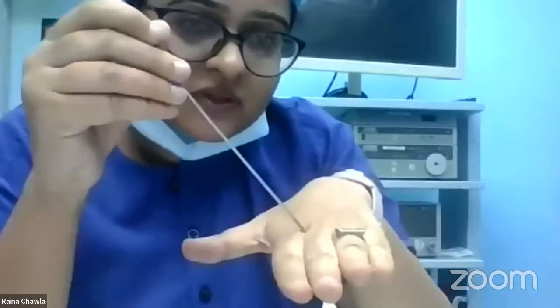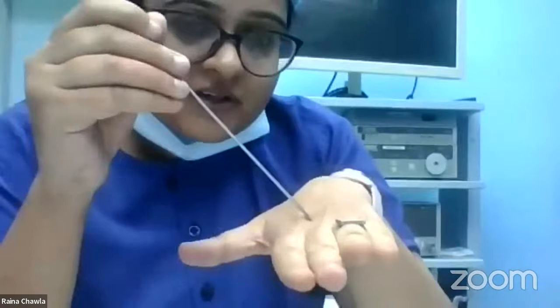We hold it at an angle of 45 degrees to the patient's abdomen. This is to avoid inadvertent injury to the major vessels in the abdomen, that is the aorta and the bifurcation of the aorta. So we introduce the Veress like this, and we hear two clicks, once when it enters the rectus sheath and then when it enters the peritoneum. So we hear two clicks. That means we know we are inside the peritoneal cavity. Very important is the angle, 45 degrees.